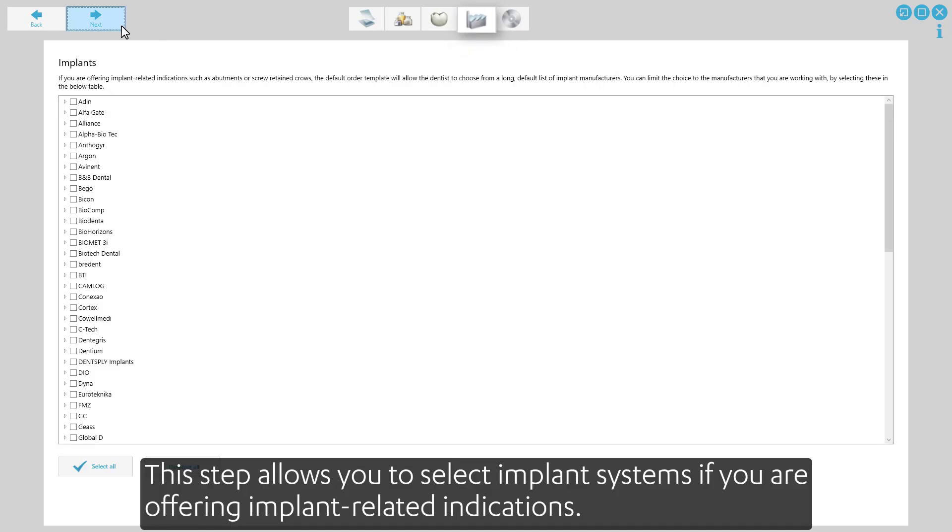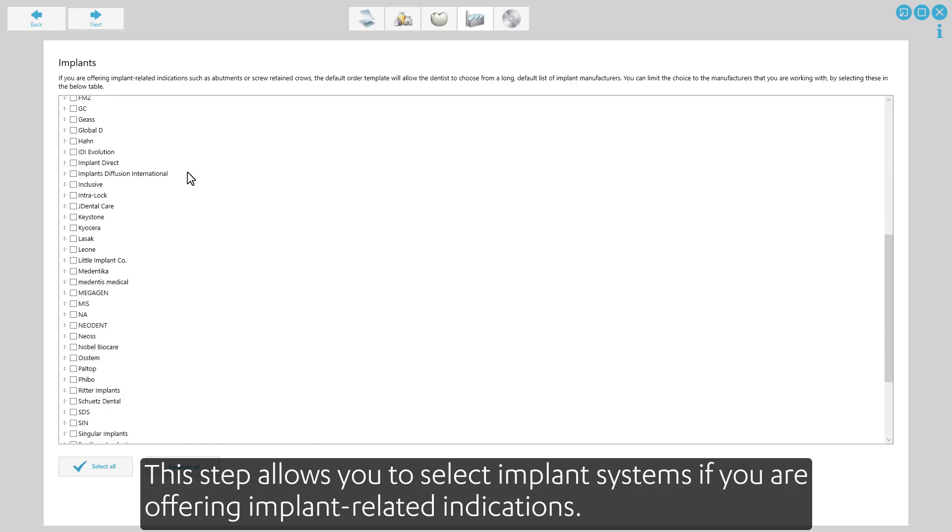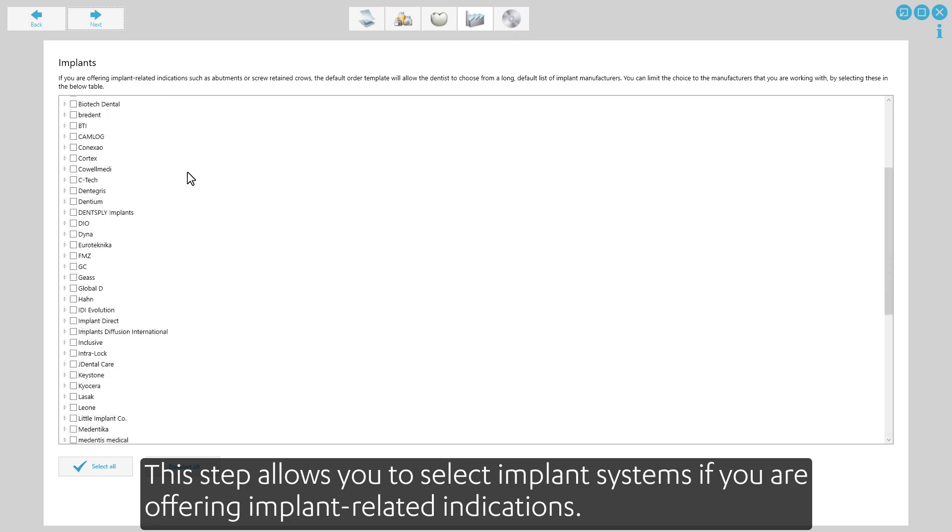This step allows you to select implant systems if you are offering implant-related indications.